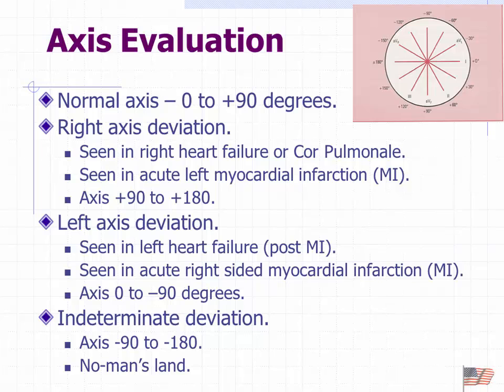Both of them will yield a right axis deviation. That's the piece of pie that's in the lower left, from here to there, in this portion. If our axis deviation points towards a right axis deviation, it's either a left-sided infarct or a right-sided hypertrophy. So far, so good?